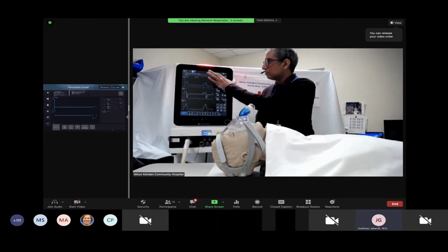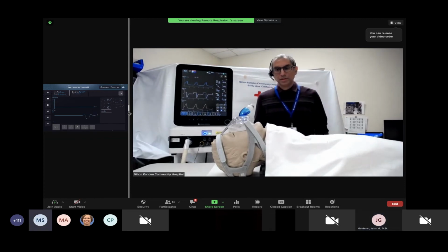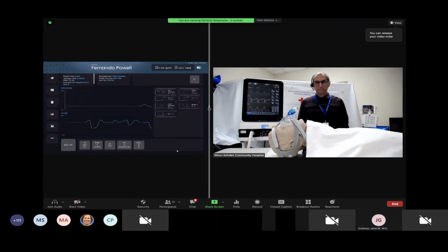Good. And in a second, we should see the waveforms populate and the alarm turn off. Looks to us like the ventilator has been activated and is breathing for the patient, Miran. Is that true? It is correct, and the patient is doing better. Excellent. When we look at our local screen, the waveforms look a little different from yours at the bedside. Alyssa, is this typical when you're controlling something remotely? Yeah, this is really just an interim version of the software. The waveforms are not quite accurate or precise, but we are still developing this software, so in future iterations we will see more accurate waveforms.